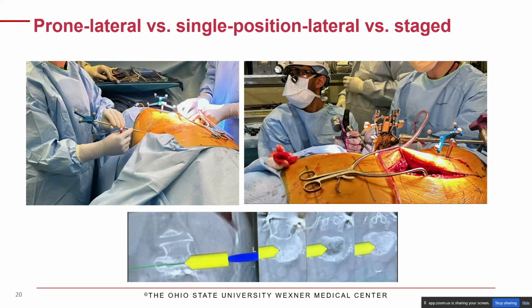These are photos from that particular case. You can see that the posterior incision was open at the same time as the lateral incision. We have a PSIS pin here to serve as the navigation reference. This is a little different from the setup I use now, which I'll talk about. You have the chief resident here working on the temporary rods, and I'm working on planning the incision for the lateral approach. And you're able to do this all simultaneously.